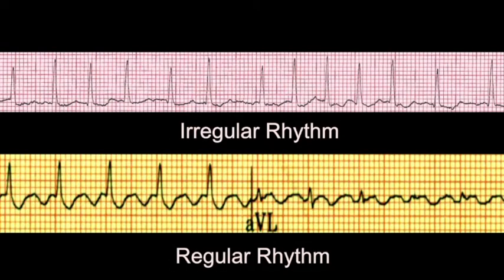There are many different approaches to the ECG interpretation of the narrow complex tachycardia. I prefer an approach that starts with sorting out these rhythms based on their regularity. This neatly divides differential diagnosis into 2 distinct categories of rhythms, regular and irregular rhythms. Let's look at those narrow complex tachycardias that are regular. The first step when interpreting the electrocardiogram of a patient with a narrow complex tachycardia is to determine whether the ventricular response is regular or irregular.